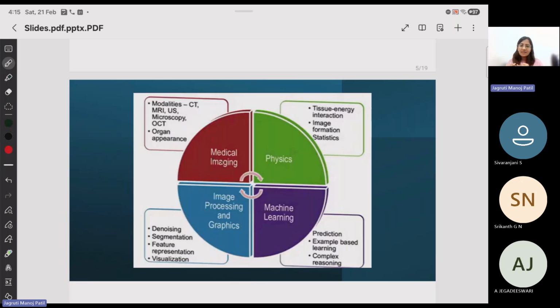That's fundus, then you have angiography, then optical coherence tomography, all of which are high resolution imaging techniques so that you can see our eye. And our eye is not much bigger, it's like a 2 to 3 centimeter region that we have to look around. The choroidal and retinal layers are very important for us to process our vision. If you have some fibers or plaques in your retinal layers, it might let the vitreous humor flow through, and you might have vision loss towards the end. So these techniques help us to see there.